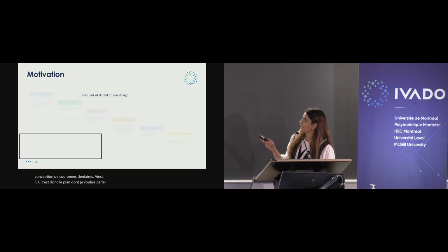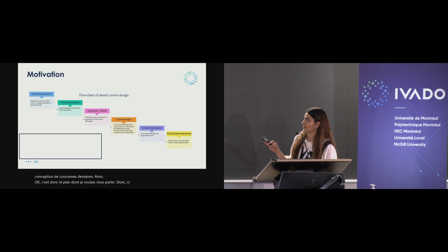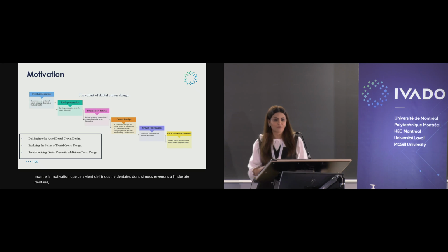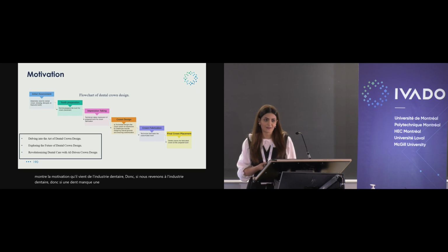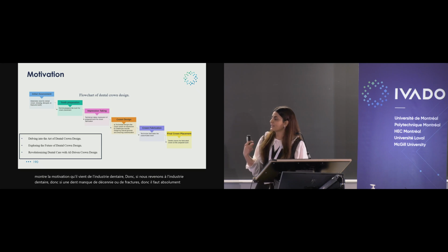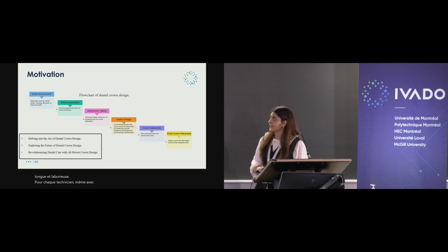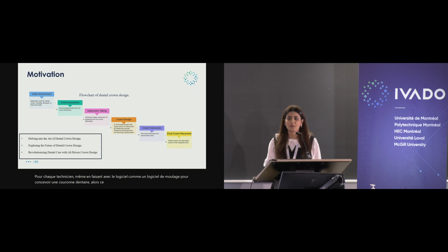The motivation comes from the dental industry. If a tooth is missing, decayed, or fractured, it totally needs a dental crown. When technicians design the crown, it is a time-consuming and labor-intensive task, even when using CAD software. The goal behind this project is to automate dental crown design for each individual patient.